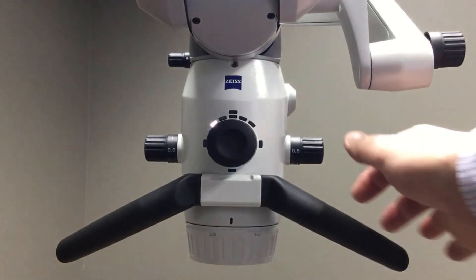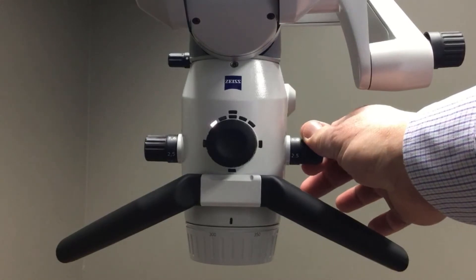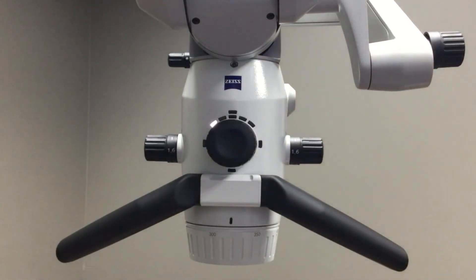The first is our five-step magnification changer. The magnification changer is positioned for both left and right-handed operators, so the desired magnification level can be easily selected and viewed by the operator.